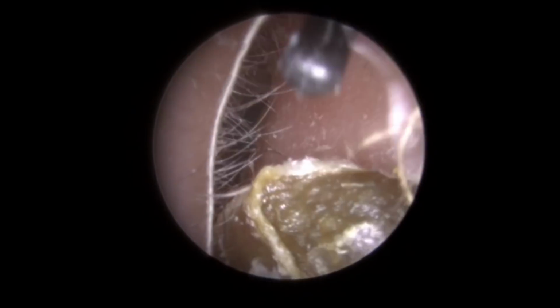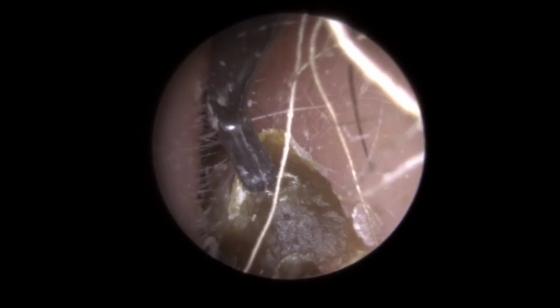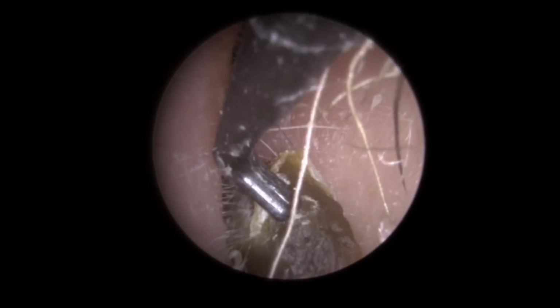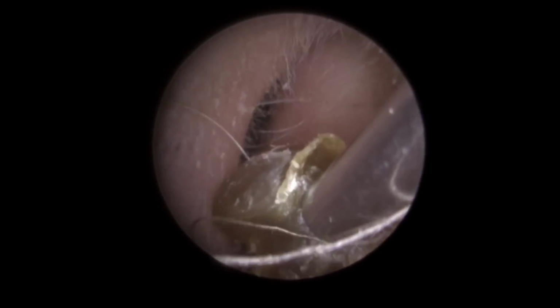Softer wax, that St. Bart's hook would just pull straight through, but because this is very, very hard pebble like wax, you can get behind it, and it had that little gap there big enough to accommodate the hook. So you can see it's got to be a very special set of circumstances personally for me to want to go in with the St. Bart's hook rather than suction or Jobson horn. But you do come across it.